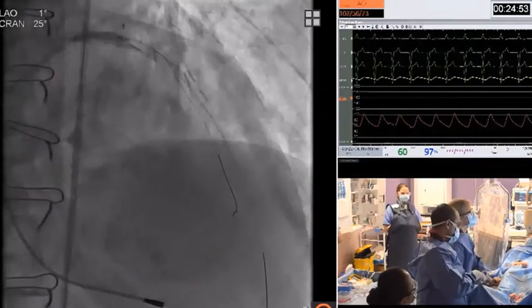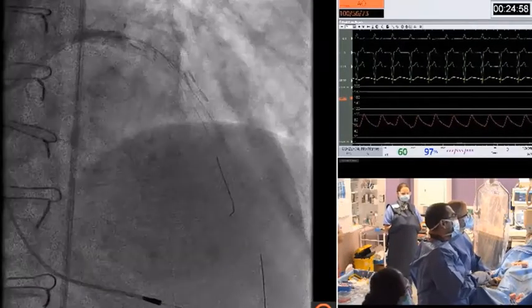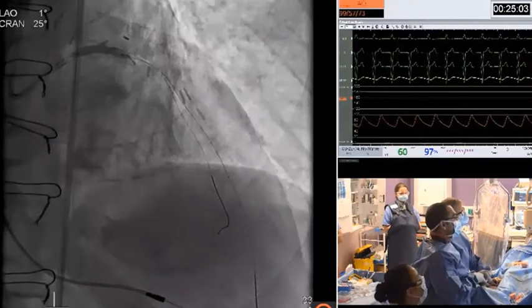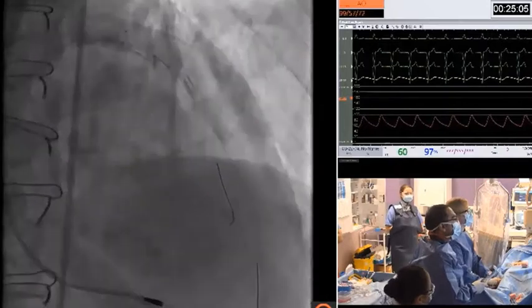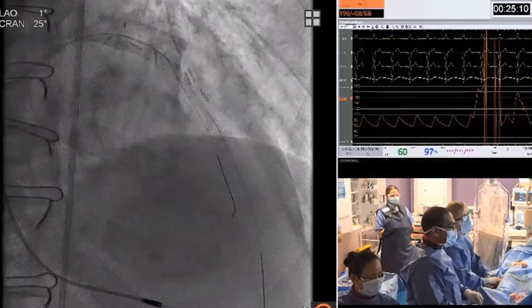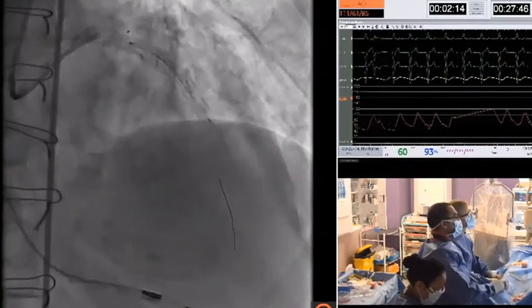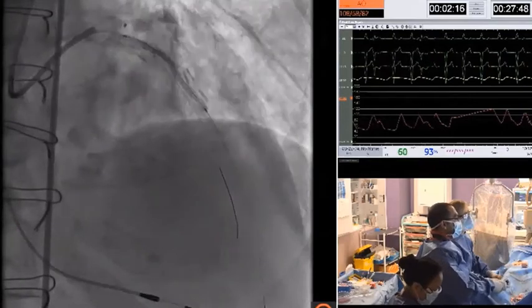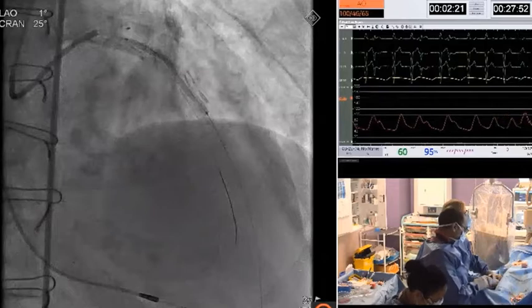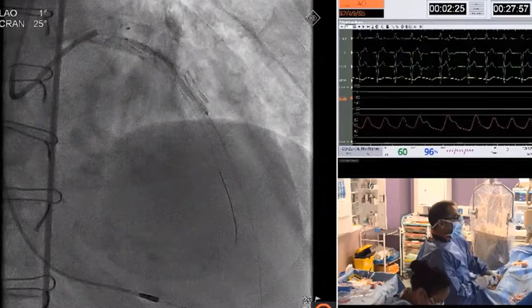We then performed intravascular ultrasound to guide our stenting strategy. And actually on intravascular ultrasound imaging, there was not too much disease in the mid to distal LAD past the occlusion point. And in fact, despite having done some pre-dilations distally, we decided to only stent from just after the occlusion point, where there appeared to be a healthy landing zone on IVUS imaging.